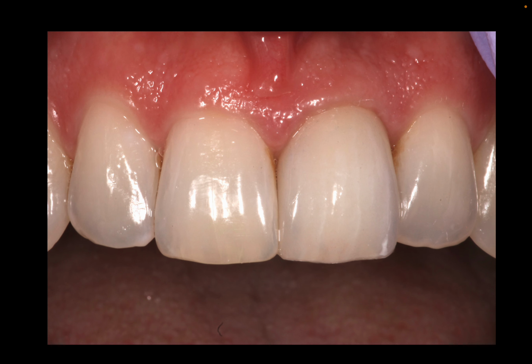Even though it's next to a more tapered tooth, we pulled off an illusion by making the distal of that central overlap the lateral a little bit, and this has the net effect of making the gingival embrasure look small. It's a little hack that you can use.